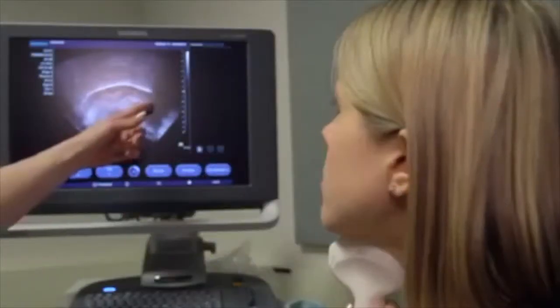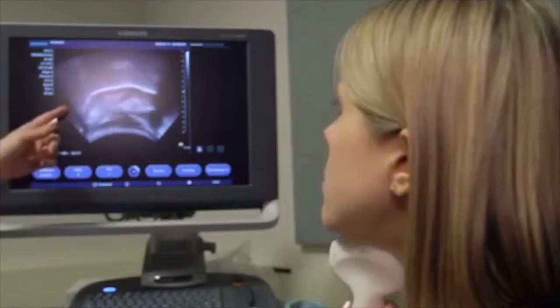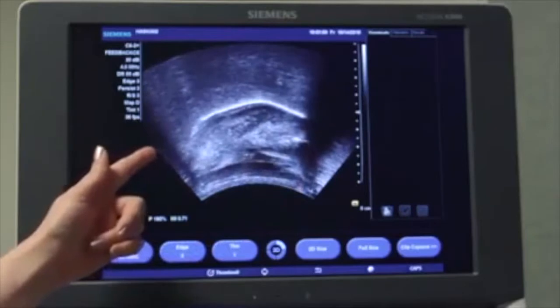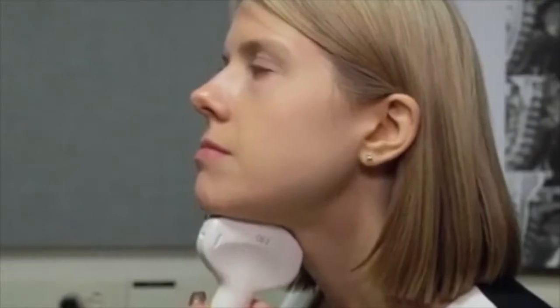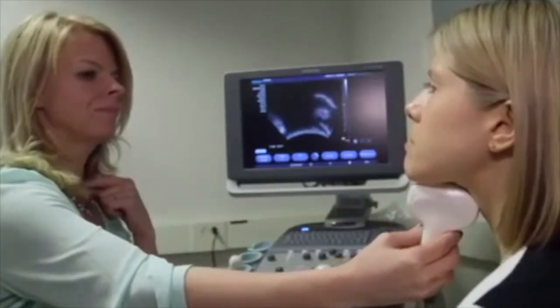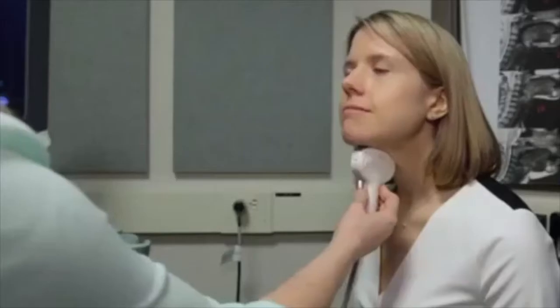Check the screen to verify that the transducer is properly oriented such that the front of the tongue is on the right of the screen and the back of the tongue is on the left. Angle the ultrasound transducer slightly forward or slightly back depending on what part of the tongue is of interest. Instruct the participant to swallow to orient the user to the tongue position relative to the palate.